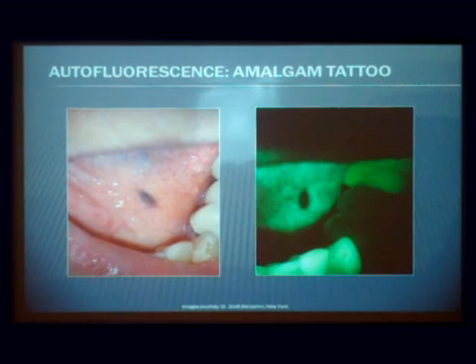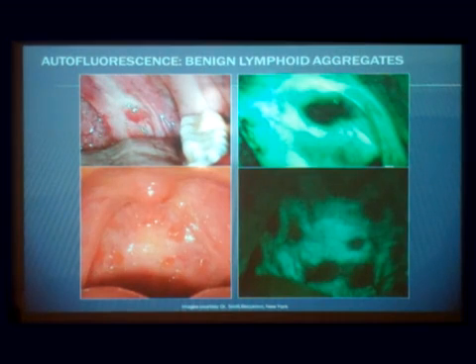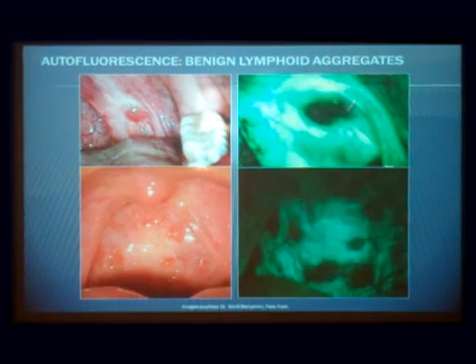And the last problem, and probably the most frequent problem, is this. We all have these little bits of tonsil stuck all over our pharynx and posterior mouth, maybe the oral floor, and we don't see them normally. They're invisible. Somebody happens to come into your office when they're coming off of a sore throat. It's puffed up, it's a little bit red, and so now you can see it. And then you use a Velscope on it, and it will be pure black, very, very dark.